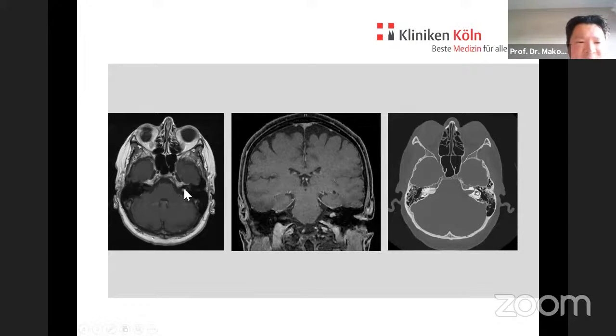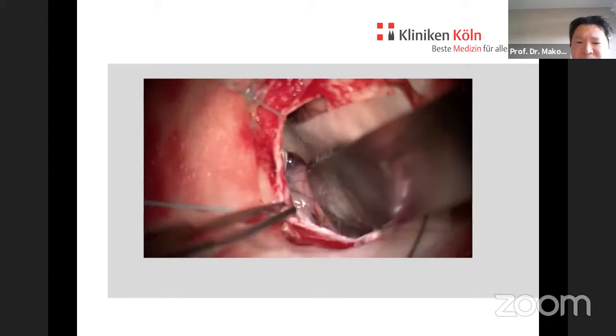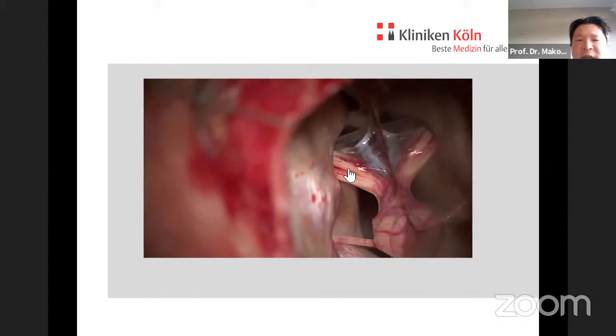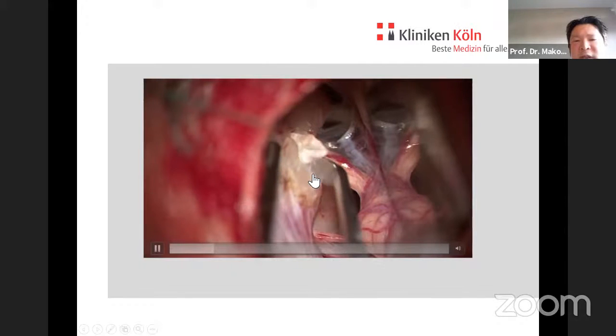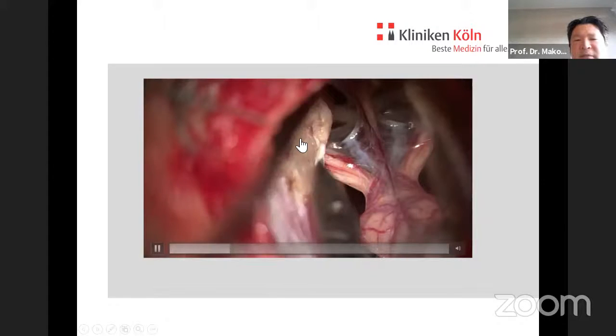Just for example, this is a small intrameatal vestibular schwannoma on the left side with a little bit of widening of the inner auditory canal. This is the view of the surgery in a semi-sitting position, coming from retrosigmoid on the left side. The cerebellum is exposed, the cottonoid is inside, and the cerebellum is retracted. You see the eighth nerve now, you see the petrous bone here, and the dura over the internal canal is cut and removed. And the tumor is inside here, so you cannot see it.